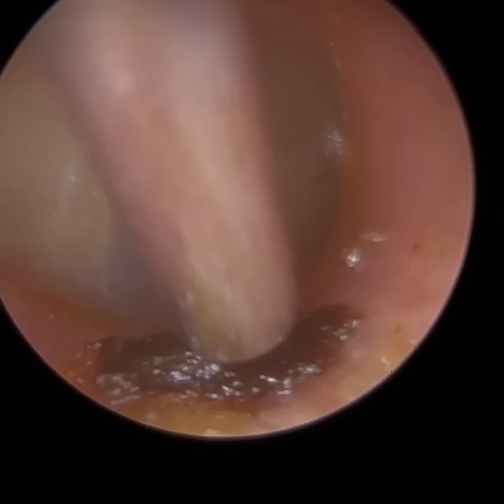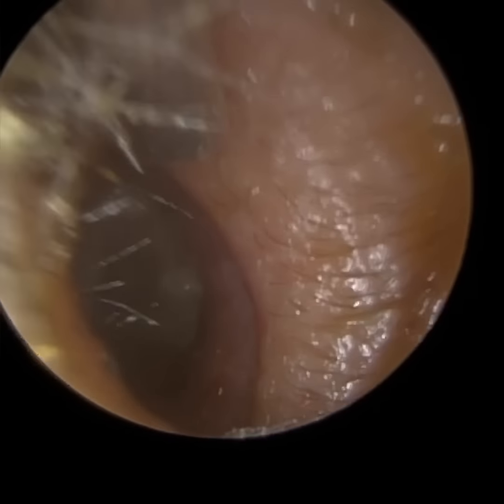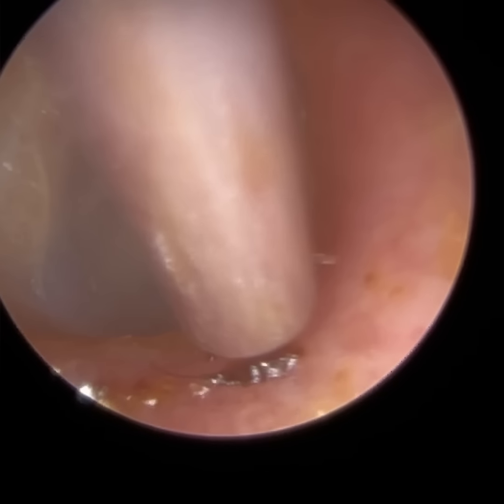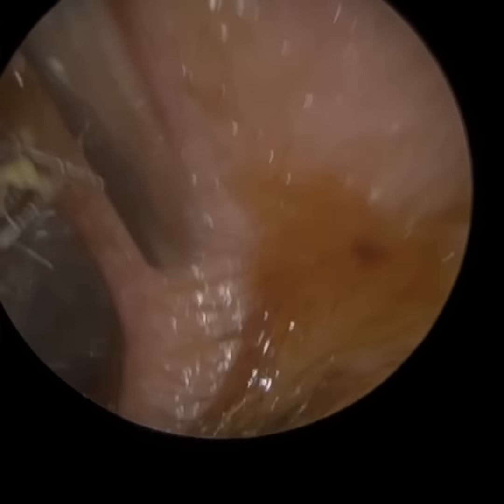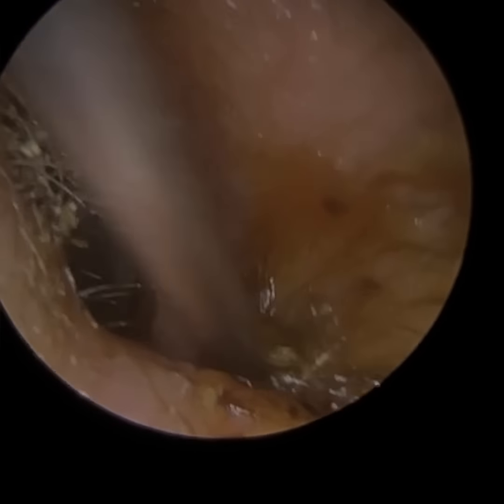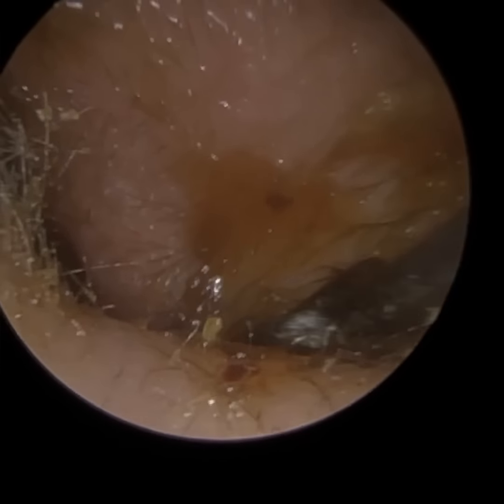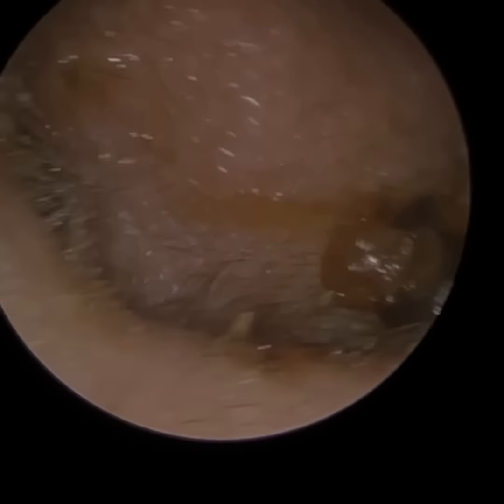If you've been watching my videos of late, more often than not when I'm removing residual wax — thick blankets of wax or skin, more so with skin — there's always a pathology hidden underneath it. But if I see a thick blanket of dead skin on the floor of the ear canal, I'm going to try and remove that if possible, because I've been spotting potential canal cholesteatomas and benign osteonecrosis very frequently of late.